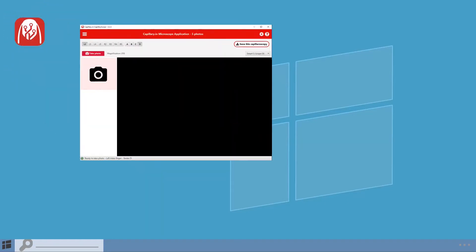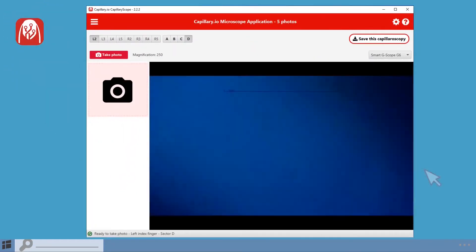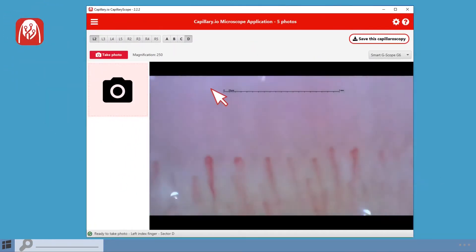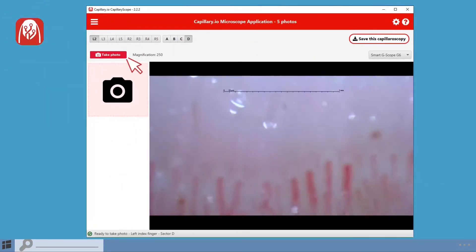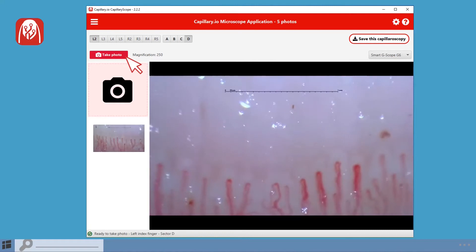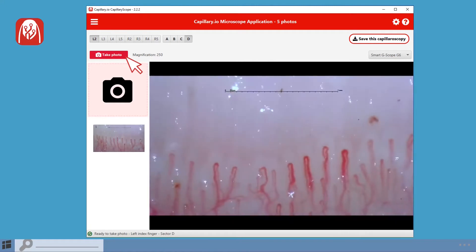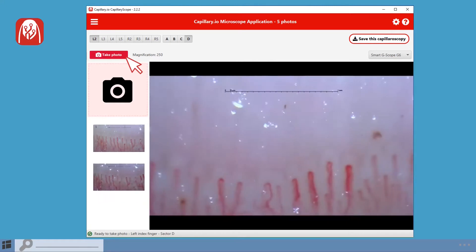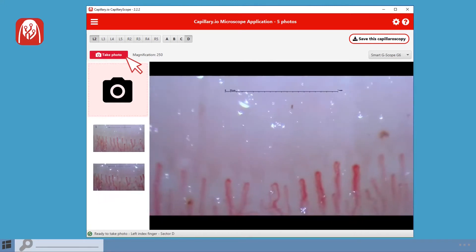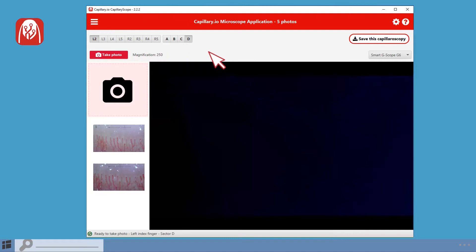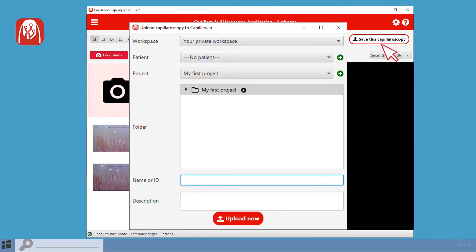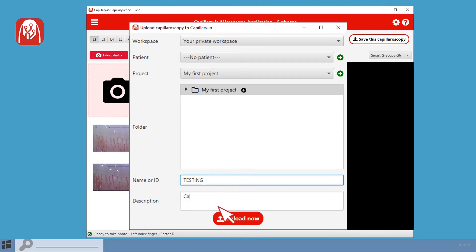Just select your connected USB microscope in the Capillary microscope application. By running the application installed on your computer, you can view the microscope camera on the screen, take all the necessary photos, save them, and send them to the server for processing.